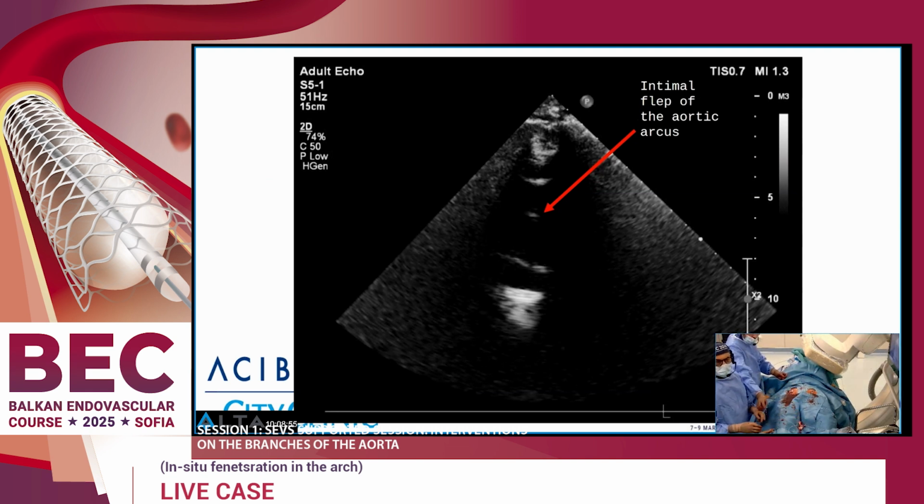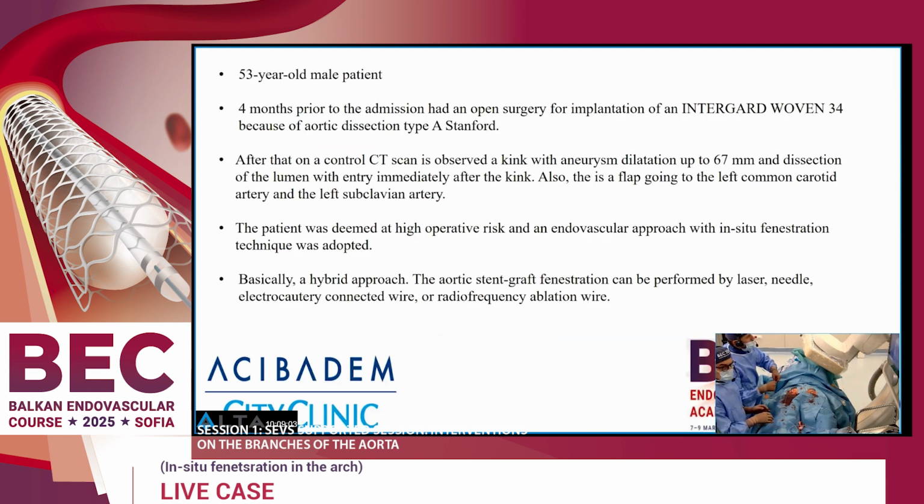Did you show the CT? We don't have the exact pictures of the CT, Professor Petrov, but I already told them everything from the CT scan. Here is the text. So you have to believe us. Yes. Okay, we are going to make an angiography in order for you to see what the anatomy is.